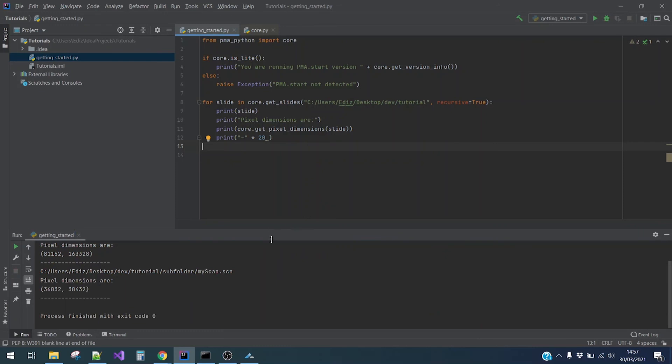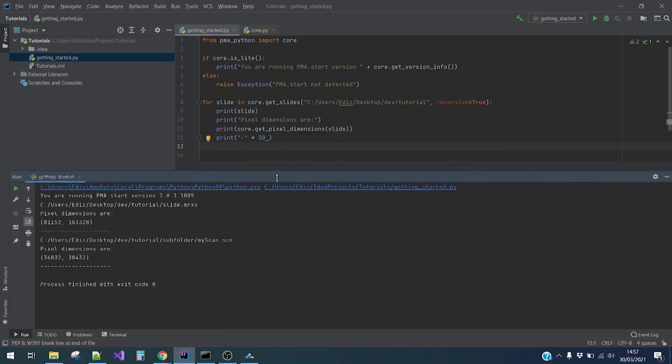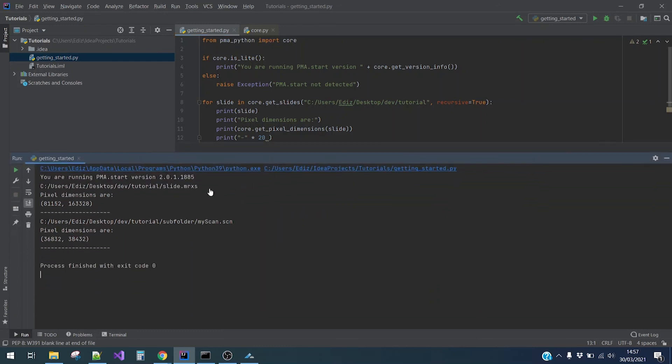Let me make the screen a little bit bigger. So as you can see, we can see the pixel dimensions of our slides here. So yeah, I hope this helps you getting started with our SDK. Thanks.